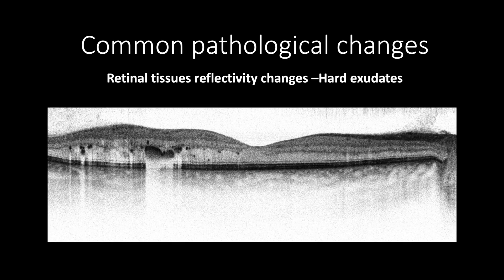In negative black and white, the hard exudates appear in shades of black with an irregular border which casts a white shadow hindering the underlying retinal tissues. In contrast, the hyperreflective dots appear as black dots that don't cast any shadow.